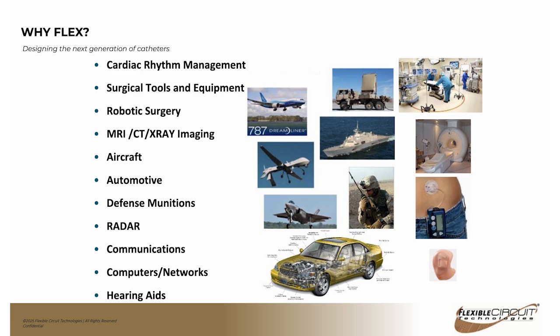Because the dielectric materials in flex circuits are so thin, and because the cross-sectional shape of our traces is roughly flat or rectangular, we can pack our conductors into a much tighter space, with only a few thousandths of an inch between adjacent conductors. The end result is a much higher connection density, which takes up a fraction of the space of a wire harness. The implantable medical market was really the first to embrace flex circuits.